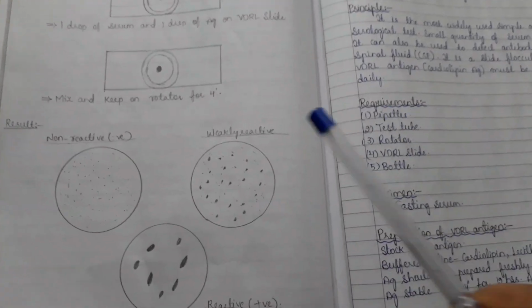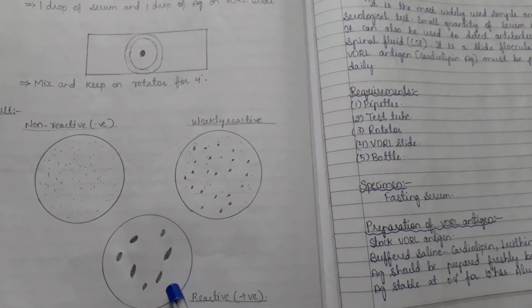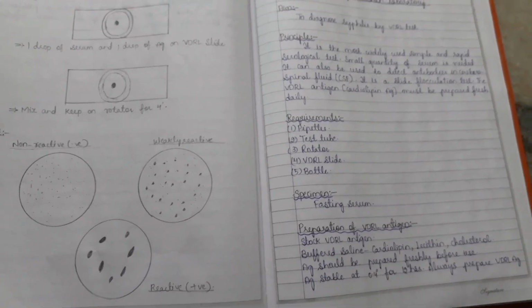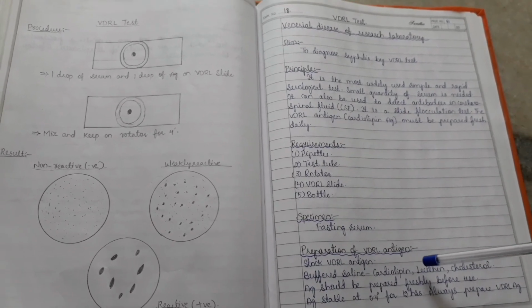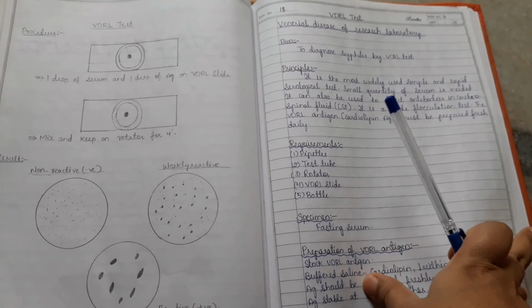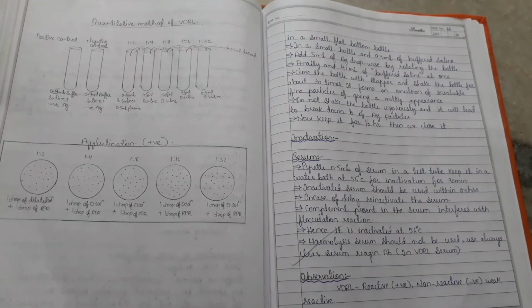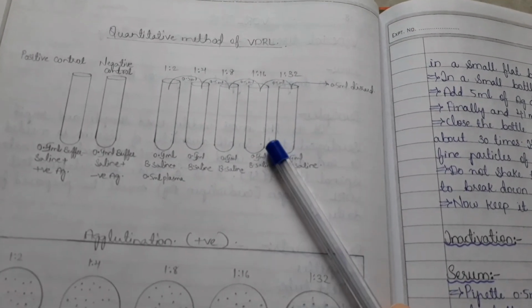So this is non-reactive, this is weakly reactive, this is reactive. Here is the principle and procedure. And this is the quantitative method of VDRL.